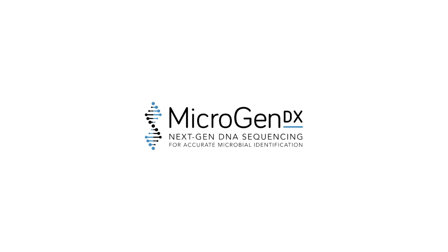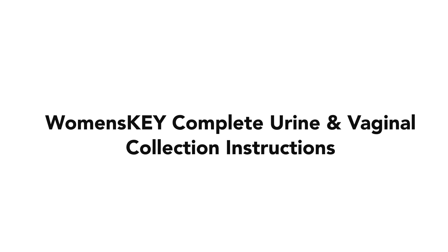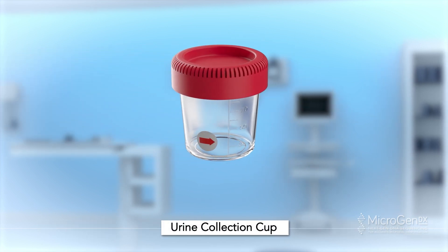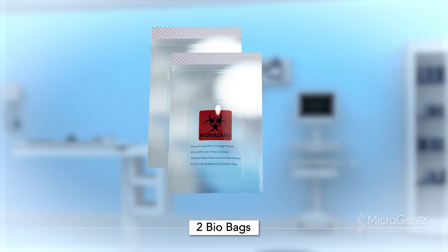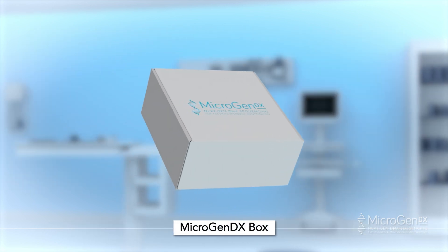MicroGenDX Collection Instructions: Women's Key Complete Urine and Vaginal Collection Instructions. The MicroGenDX Collection Kit includes 2 vaginal swabs, 1 90ml collection cup, 2 BioBags, 2 lab requisitions, and a MicroGenDX box.